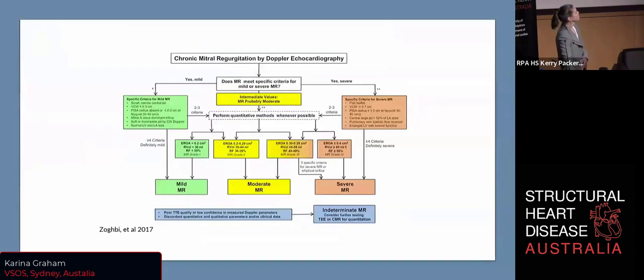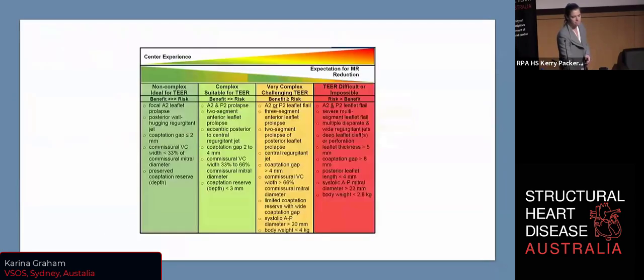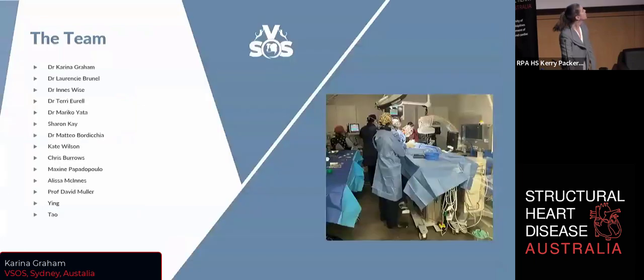And so I won't dwell on this too much. You all probably know, but we're, again, using very similar criteria to you for the dogs to determine mitral valve severity. This algorithm was put together from the Colorado team's center experience with placing these devices and which candidates we're choosing. They never fit beautifully into the ones you want, but it's a guide, and I won't go over it too much, but it's very similar to what Dr. Little presented before.